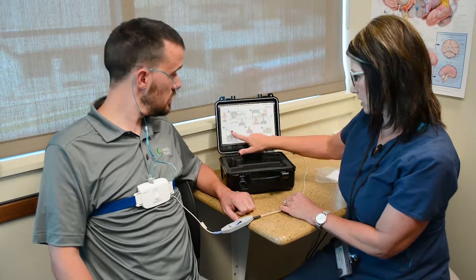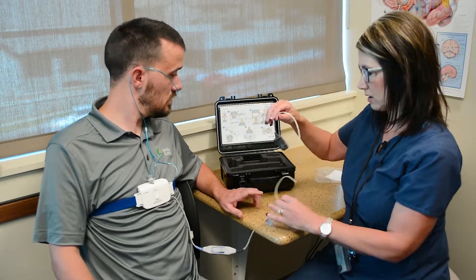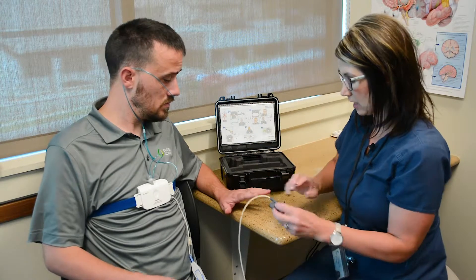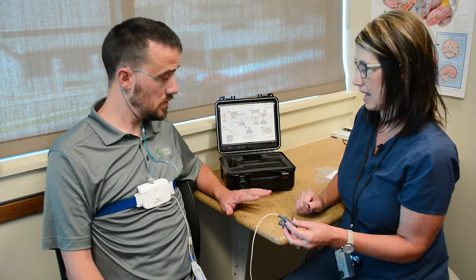The last thing we'll be doing is monitoring your oxygen level, which will be correlating with your breathing. In order to do that, you're going to wear this sensor on your finger. It can go on any one of the three middle fingers, usually on the non-dominant hand.